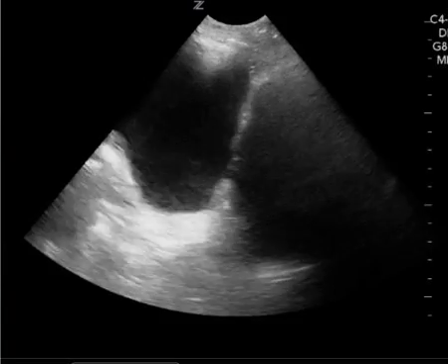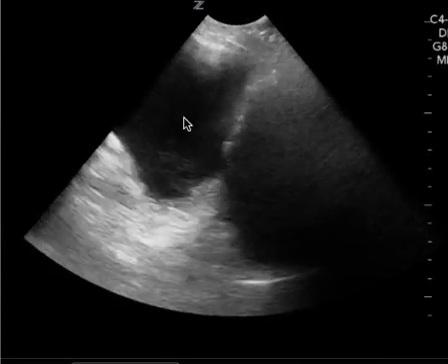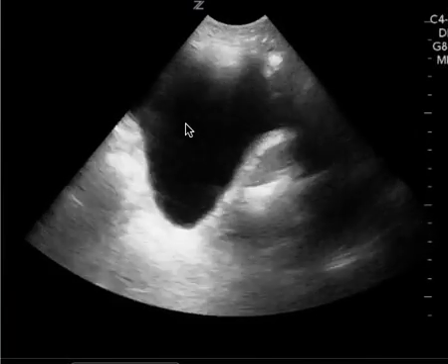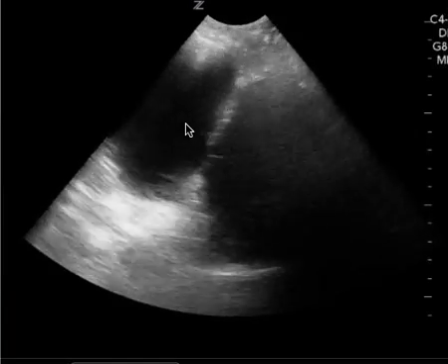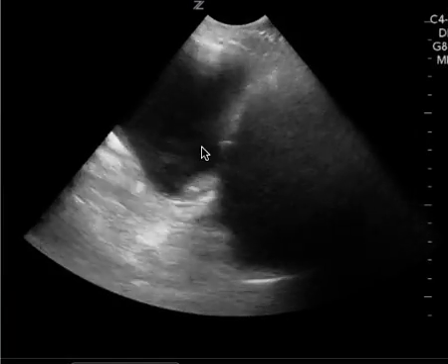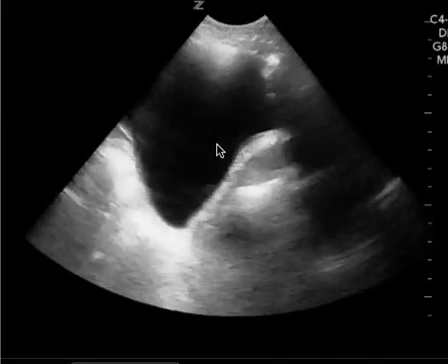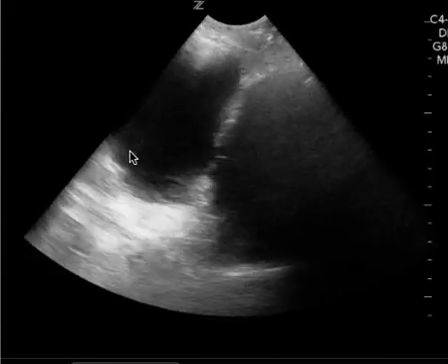So to go back to your patient here, I see this black anechoic finding, but I don't know if this is bladder or if this is free fluid. And so if you saw this on its own, you can't make that decision. You need to be able to find the bladder, which I believe this is, keep it in the center, and then look around it to see if there's another anechoic structure nearby.